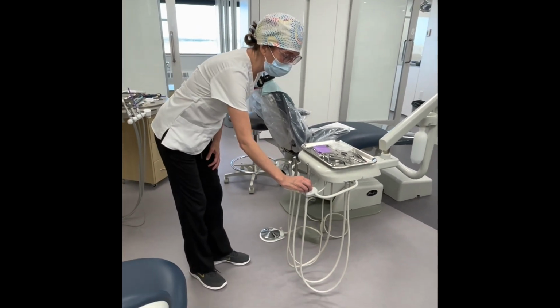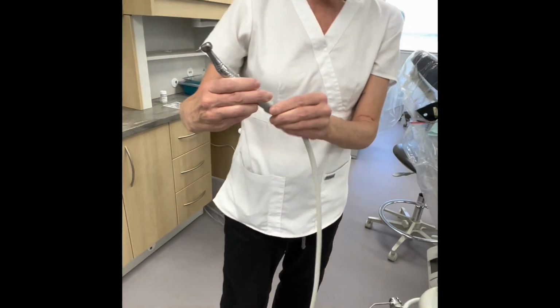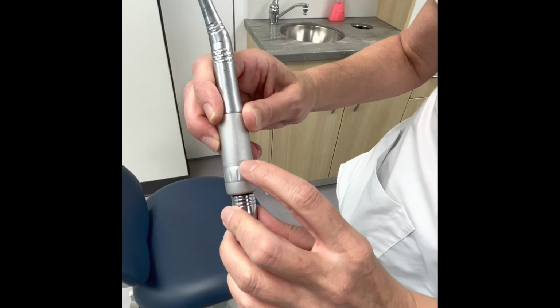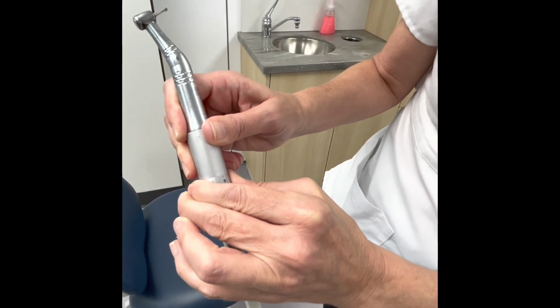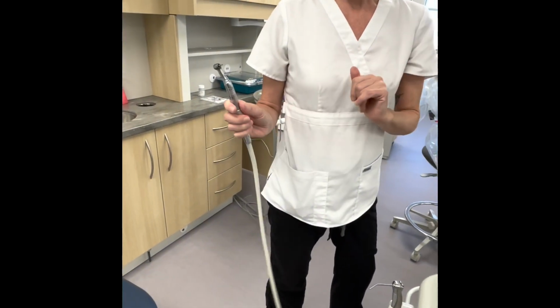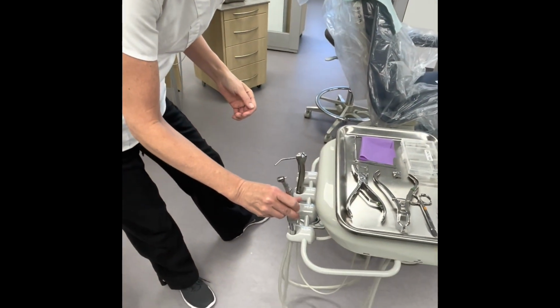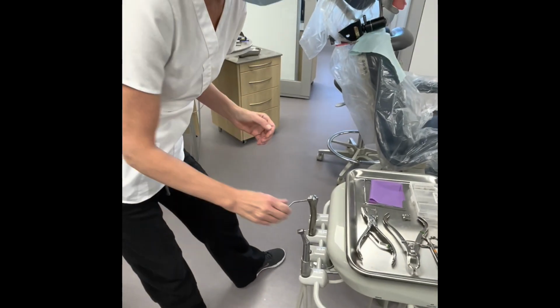So what I'm gonna do first is run my low speed. Typically it will be set at 0. So I have a reverse, neutral, and then a forward button. I'm just gonna turn this towards forward, and then I'm gonna give it a little bit of a run. Okay, it's running properly, so when my operator picks it up, it will be working. I'm gonna place it so that the burr is facing towards the tray troll, okay?